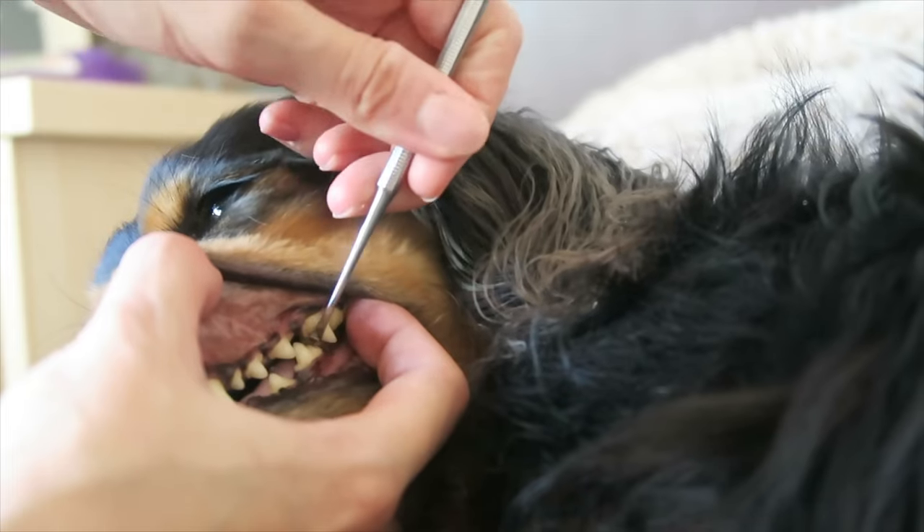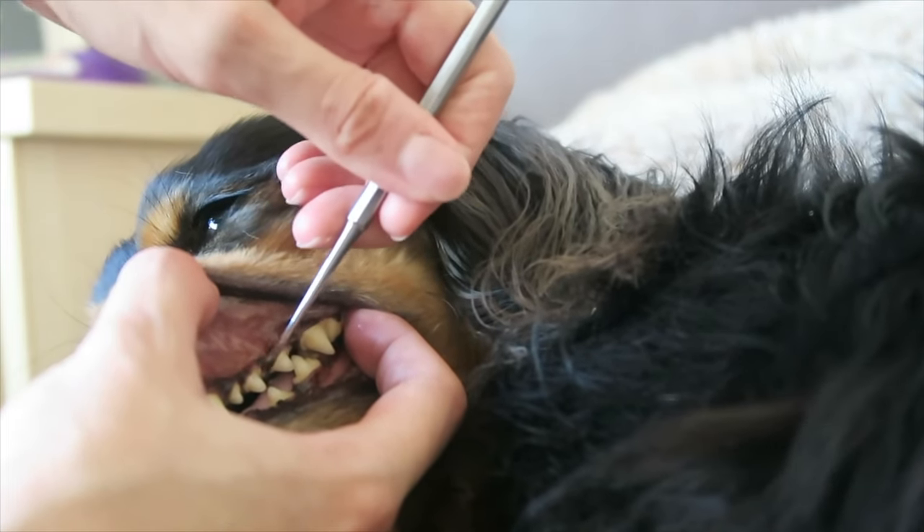Do the tops of the teeth, go all the way to the back, and do the little ones as well. They don't need as much work but they do need it.